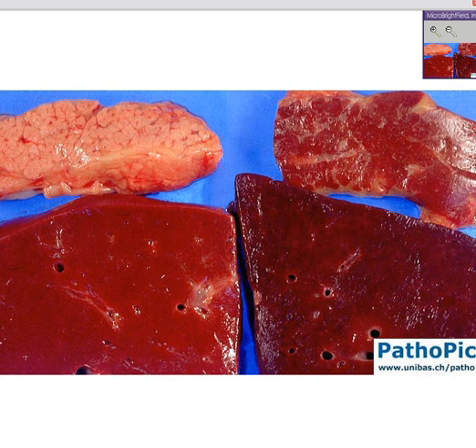Here's another nice case. It's called liver lymph node hemochromatosis / hemosiderosis. Well, we already learned the difference between chromatosis and siderosis, so just look at some more cases. Here's a liver. It is kind of brownish. Here's one that's a lot browner than this one. And here's a cut section of it as well.